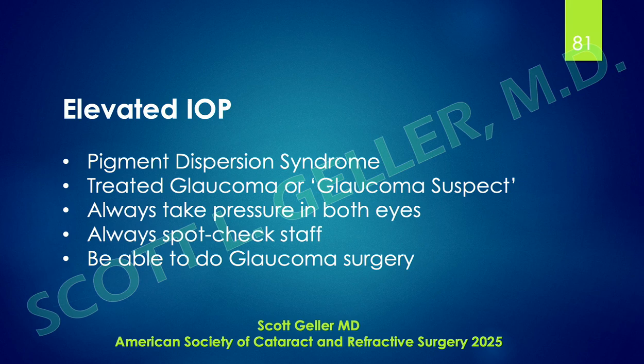I assume it was one of his early cases. Had a referral from an ophthalmologist that was treating glaucoma in this patient. The patient in the medical record had an implant with a capsulotomy that had vitreous prolapse. The patient went in because he had, I'm not sure what kind of floater.